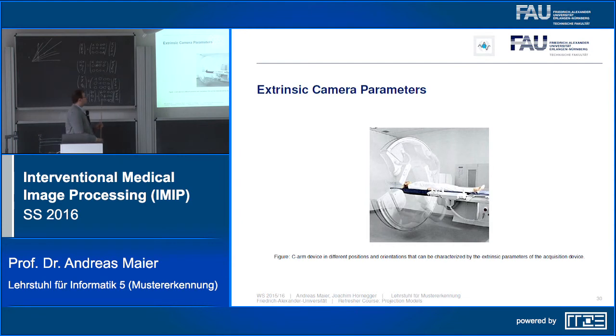There's one thing that actually bothers us a bit. This C-arm here is actually not perfectly rigid, but the source side is much heavier than the detector side. So what will happen is that the C will slightly change its shape. If you have the C positioned like this, and this is our source, then gravity will pull it downwards. So the source will be slightly closer to the detector than in the opposite direction, where gravity will pull the source downwards. And this will slightly increase the distance between source and detector. In a typical C-arm system, this can make up to 1 centimeter.